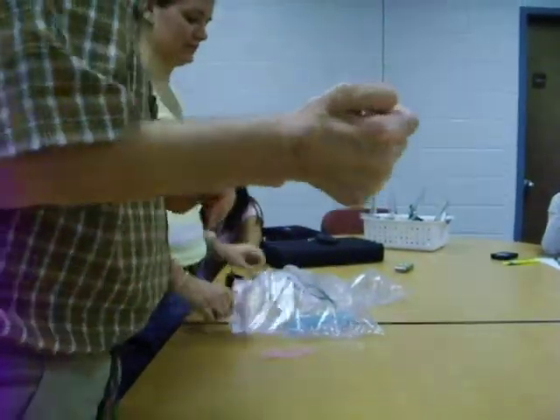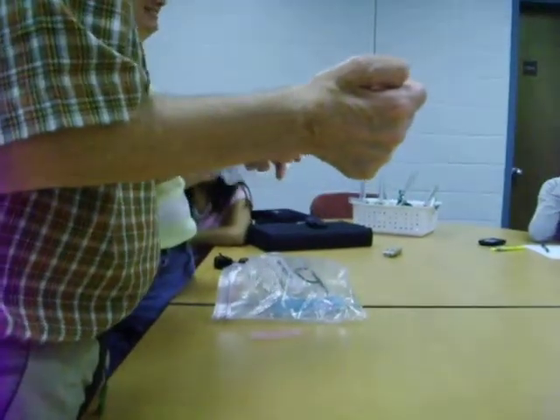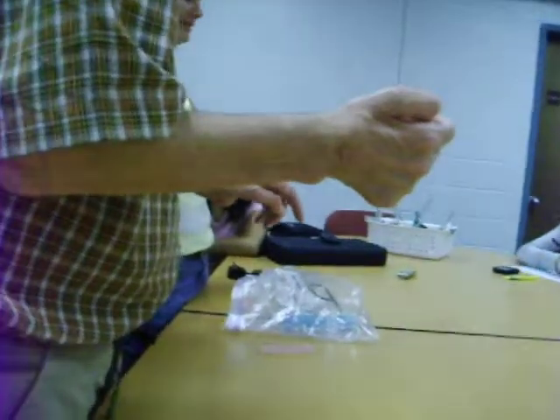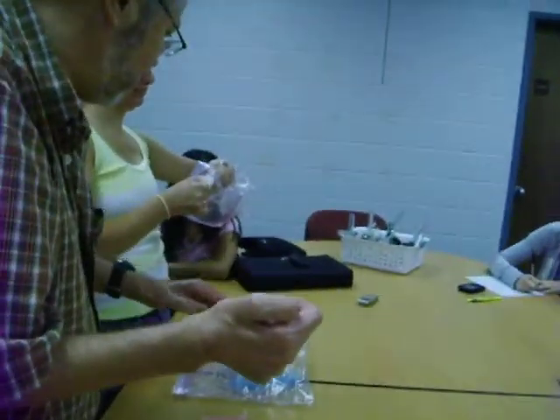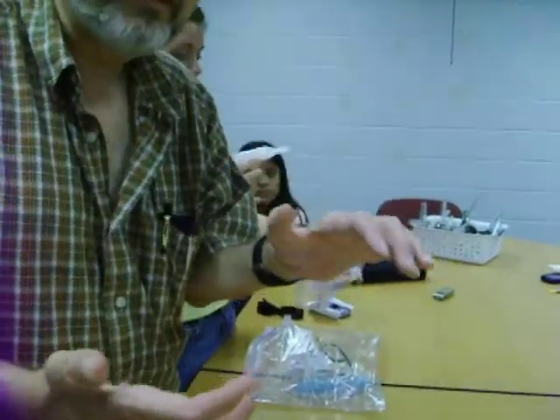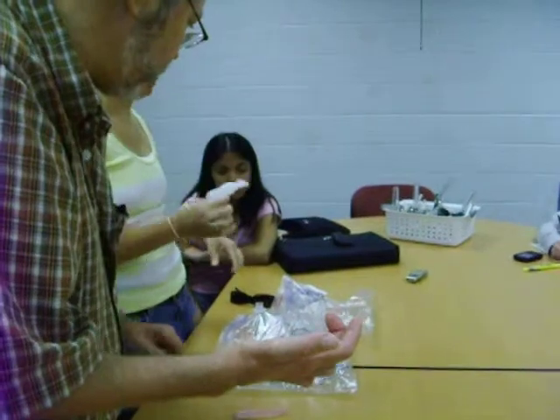That's what I want to emphasize. Assemble it so that you don't touch it. Now, you've got that together, and you'll have your gloves on. I want you to have gloves on to do this. Then you put your nebulizer together.